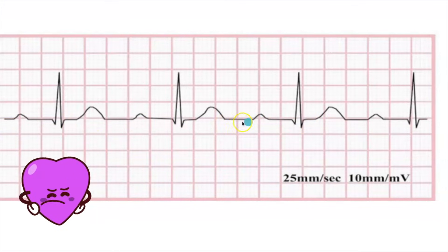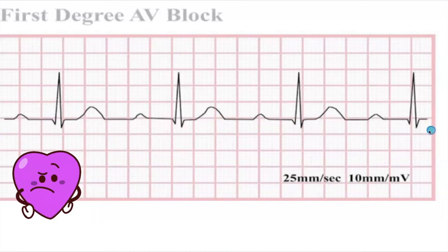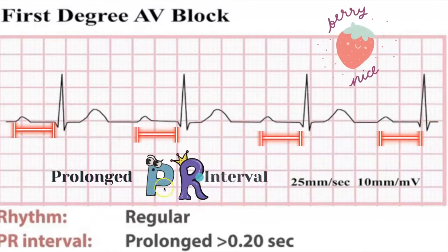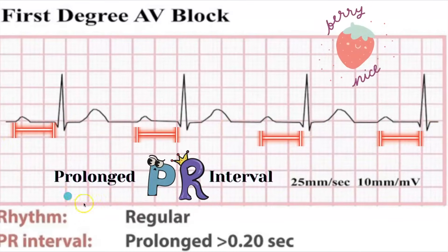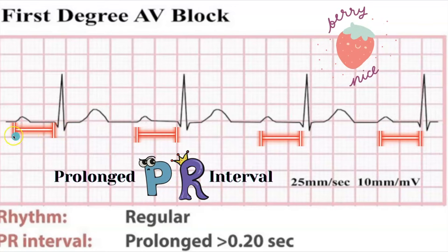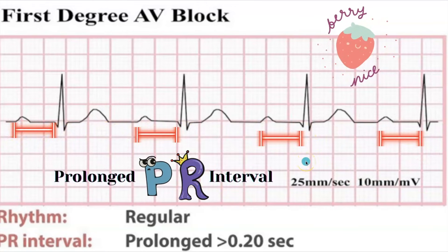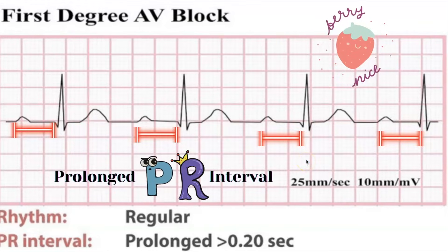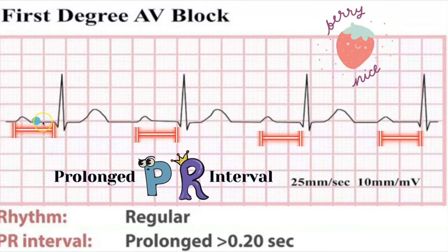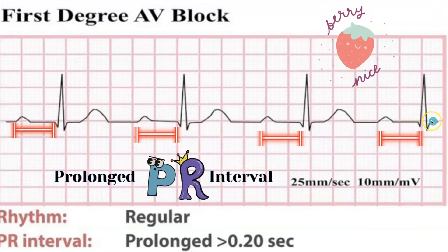This interval here looks regular — it looks like it's about the same throughout. Because it looks consistent, this is actually first degree AV block. You have a prolonged P-to-R interval — it's greater than 0.20 seconds — but there's no block, because every single P wave eventually does get its QRS complex.